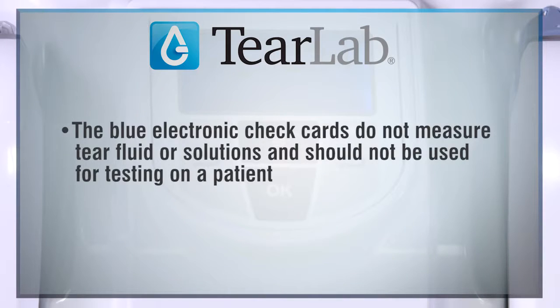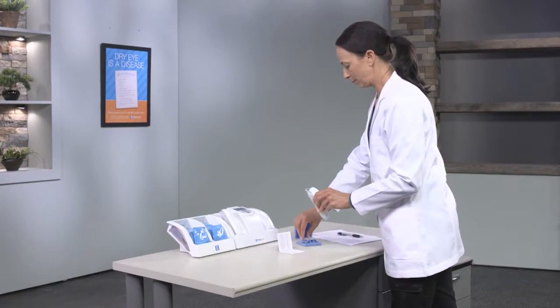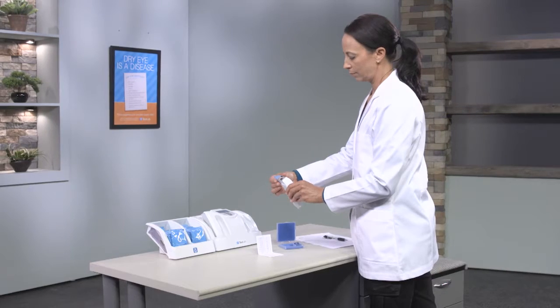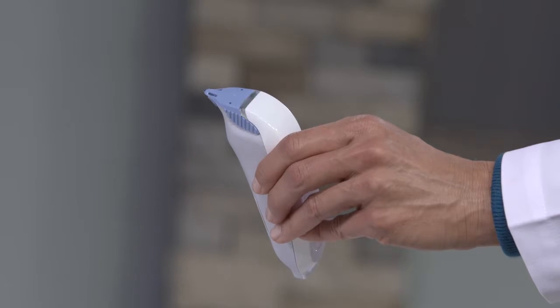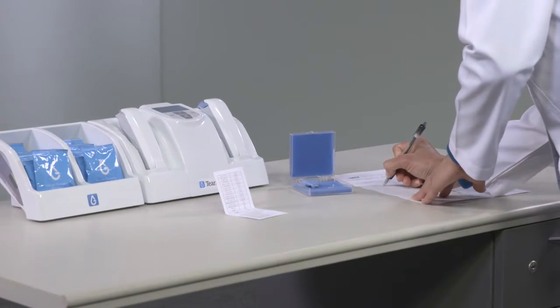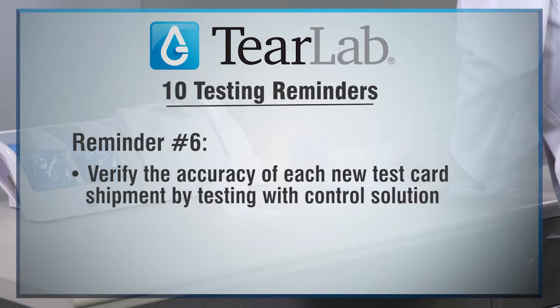As a reminder, they do not measure tear fluid or solutions and should not be used for testing on a patient. It is important to use the electronic check cards once per day on the days that patients will be tested to confirm that the system is working properly, or if, for example, you dropped a pen and want to make sure that it is not damaged. Record the test result in the quality control log. Reminder number 6. Verify the accuracy of each new test card shipment by testing with control solution.